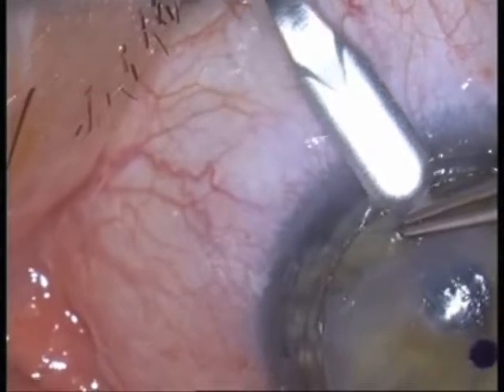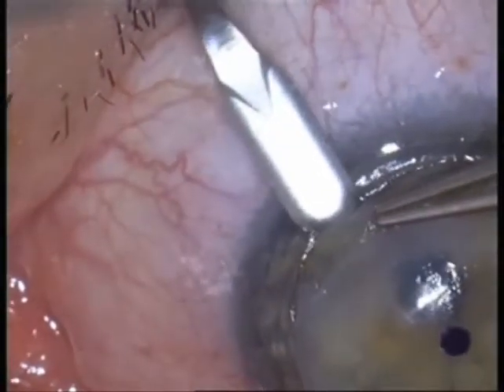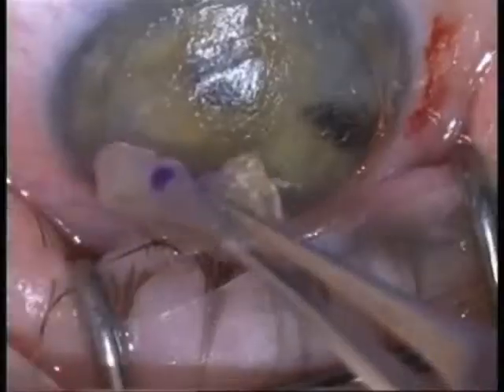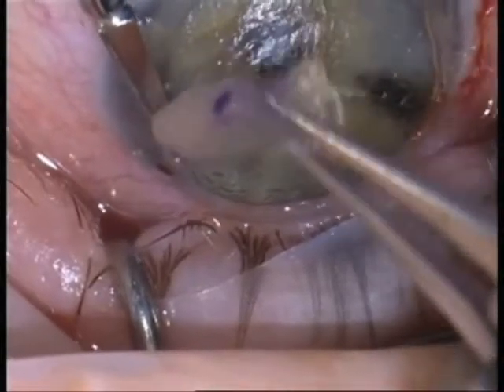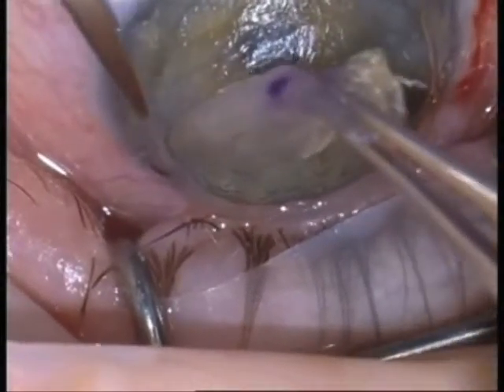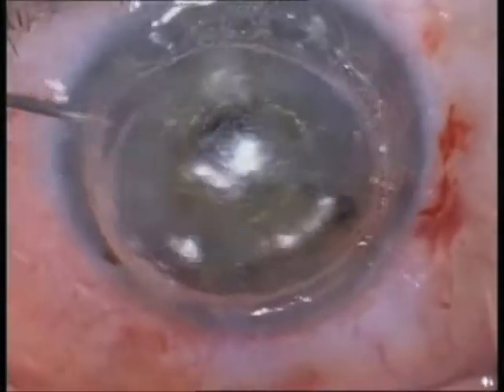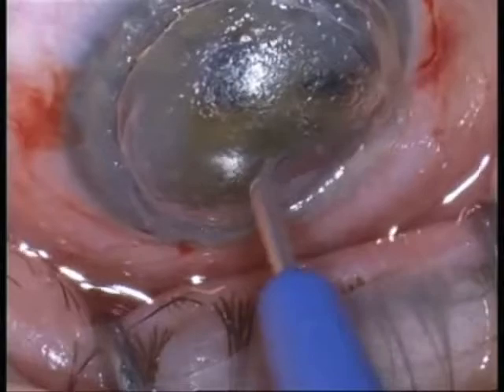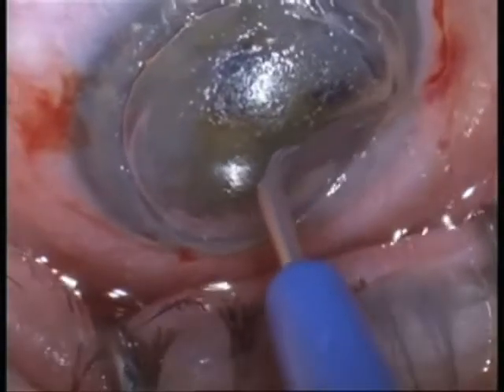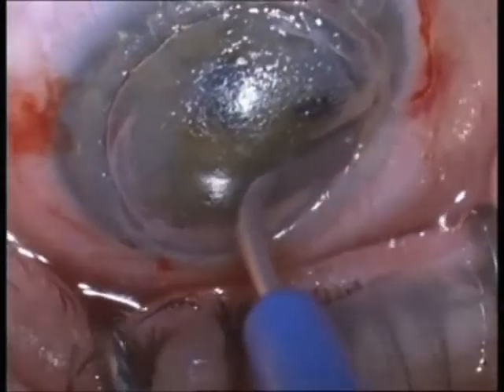After trephination, a centripetal dissection is carried out to excise the central anterior stromal disc. Next, a centrifugal lamellar dissection is performed using a crescent knife to create a peripheral intrastromal pocket.